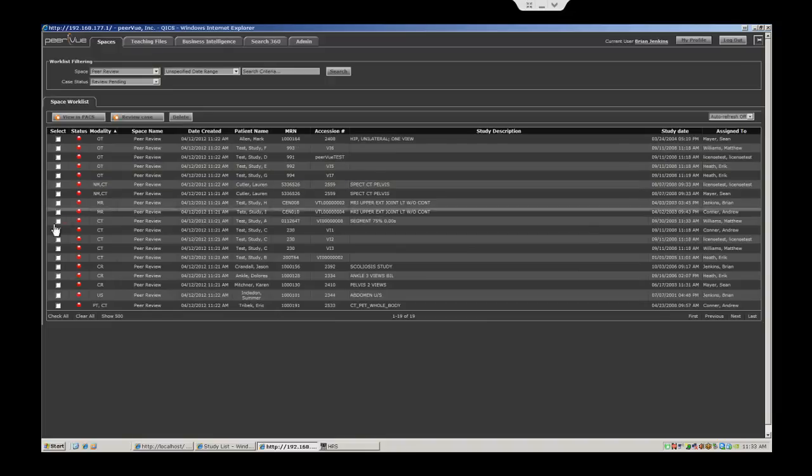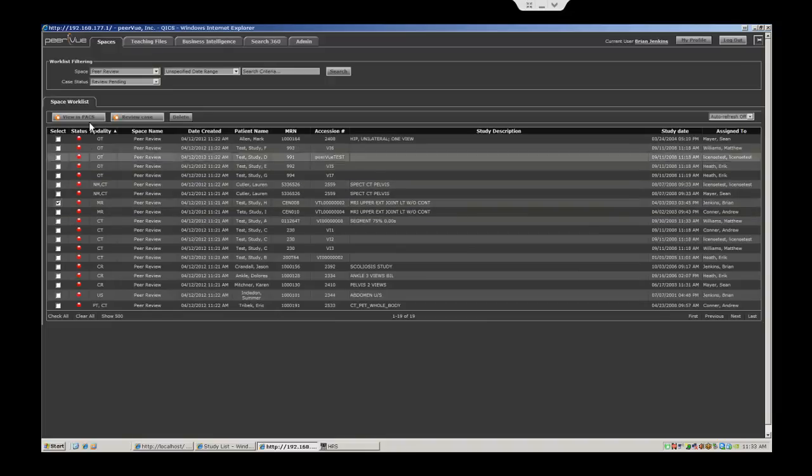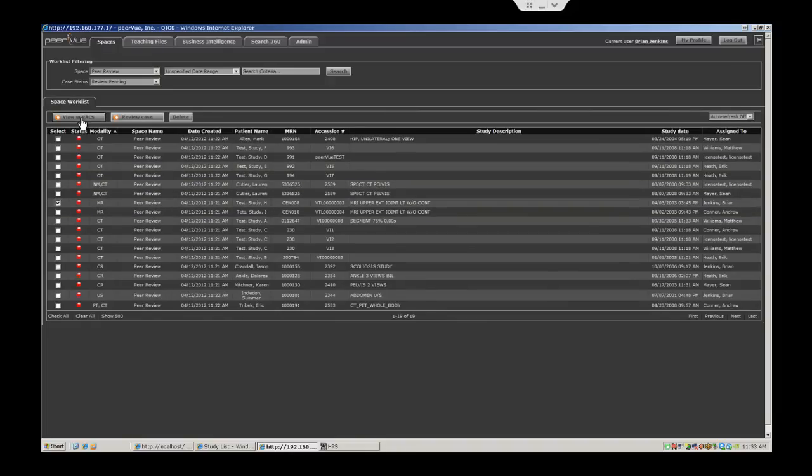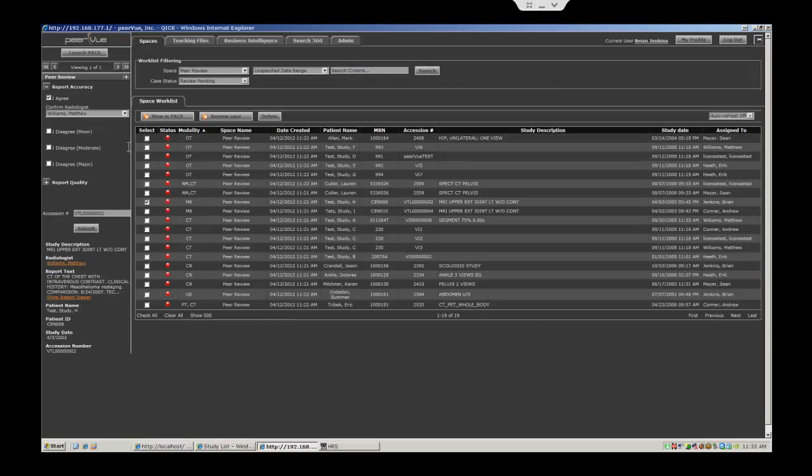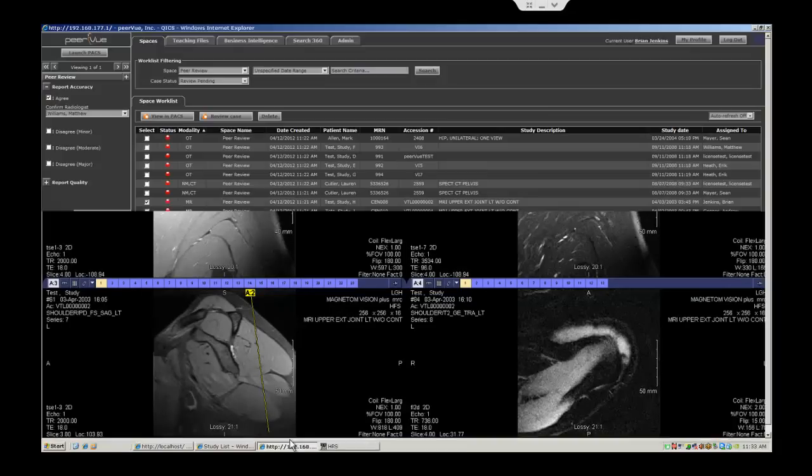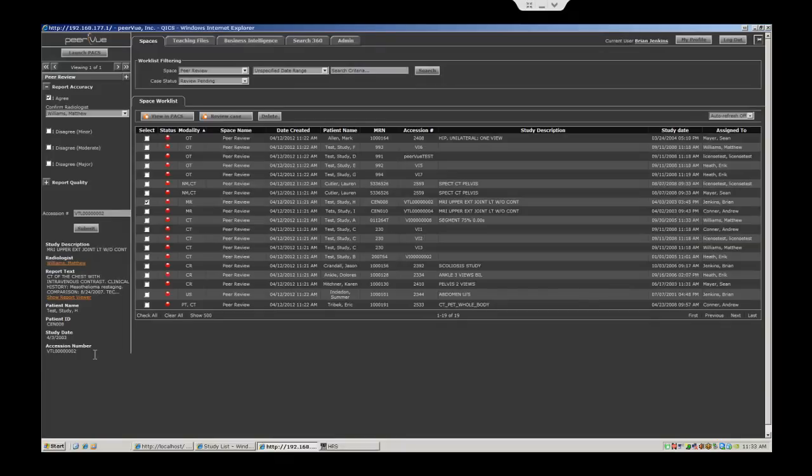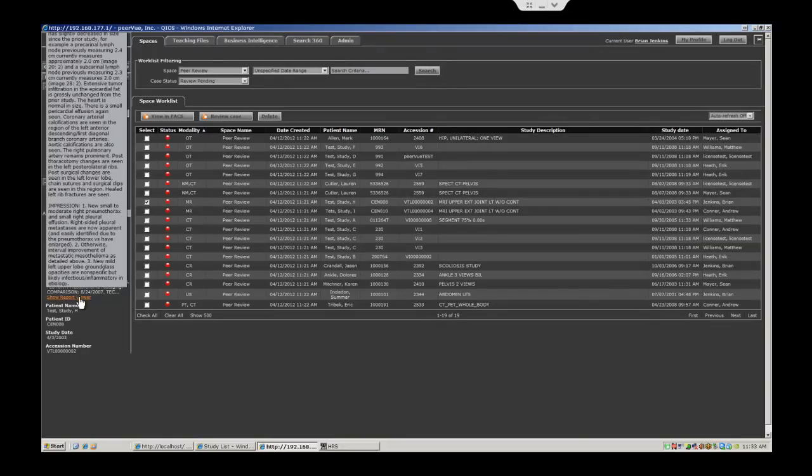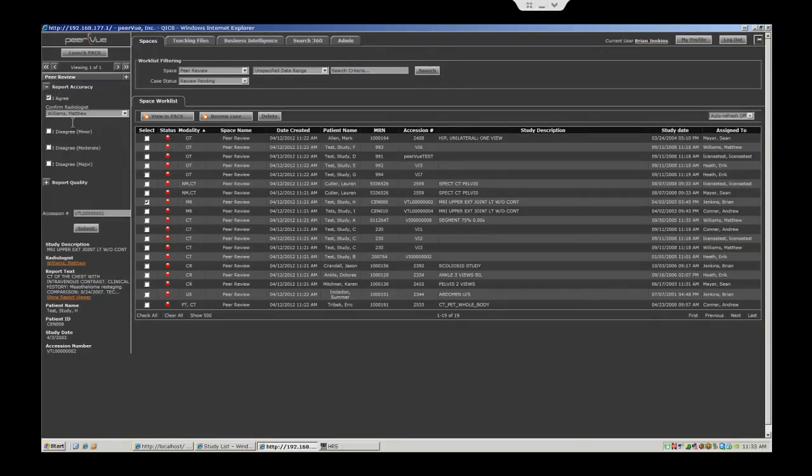They would simply tick the box for the case assigned to them within PeerView, click View in PACS. It will simultaneously drive to that specific assigned case in PACS while simultaneously displaying in the PeerView application the original report, as well as the agree and disagree criteria.